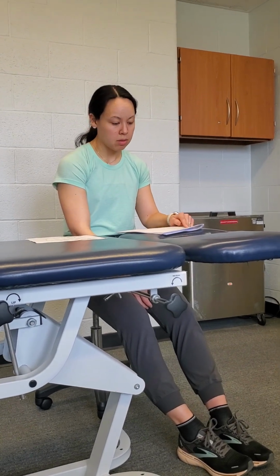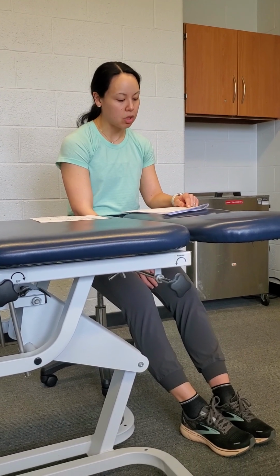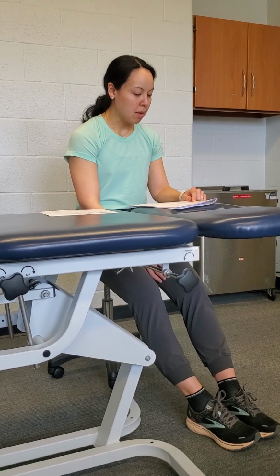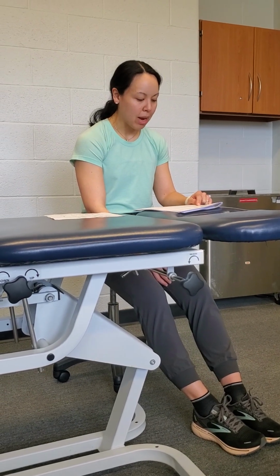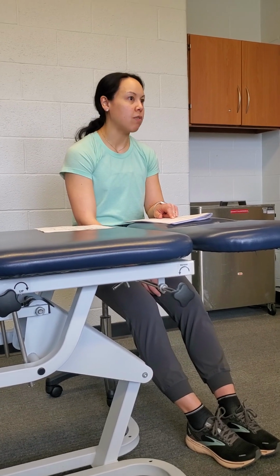What affects the pressure? There's a lot of different things. So the cuff width, systolic blood pressure or limb circumference of the particular patient, body position, female or male, limb density, and laterality. The cuff width and the limb circumference are the biggest factors.